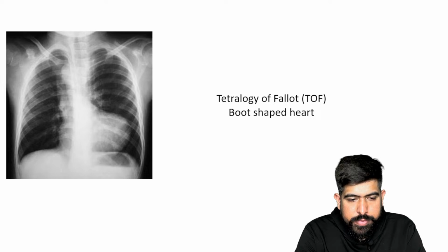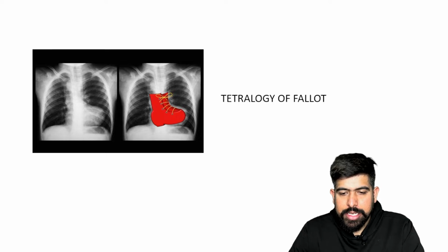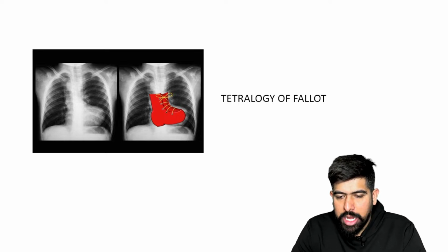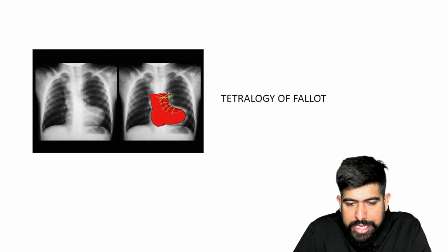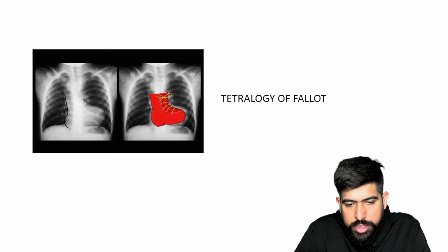Can you see this? This is the boot-shaped heart. Yes, very good. So this is seen in the tetralogy of Fallot. You can see now there is a boot. It looks like a boot inside the heart. So this is the boot.